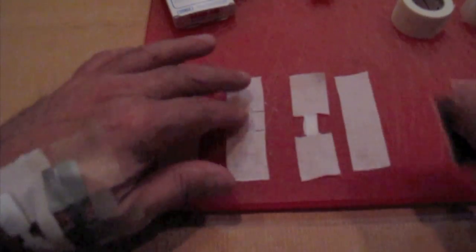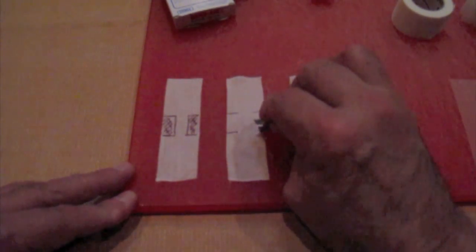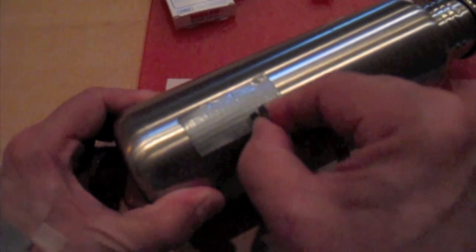The way we do this is simply put the tape on perhaps the bottom of a plastic or metal camp plate, or sometimes I will take my water bottle and I can do the same thing by just making two little cuts. In this case, I'm using duct tape. To get the bandage ready, we just fold those little tabs backwards so it's sticking on the tape in the back, and we're making that non-adherent bridge that will span the wound.